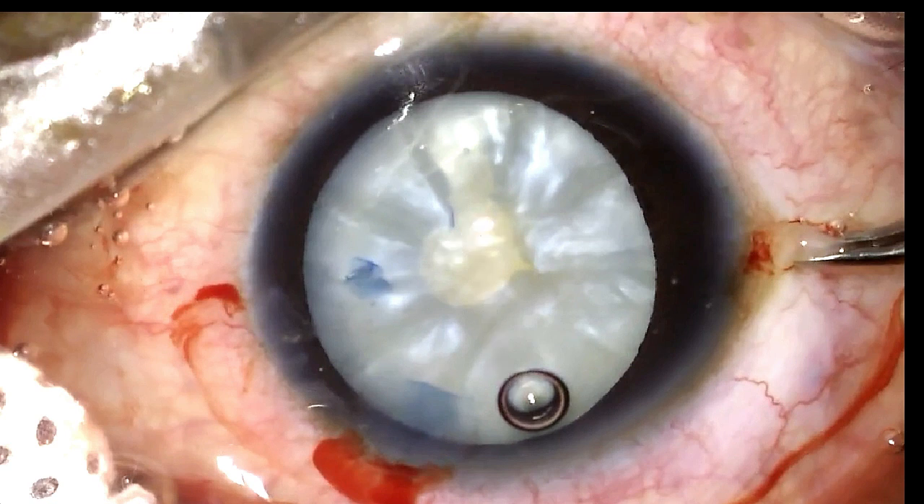So what are my options here? Either I enlarge this capsulotomy by making multiple cuts in the anterior capsule and convert to a manual SICS, but what I decided to do is try to enlarge the rhexis and attempt to perform phacoemulsification. Let's see how we managed this case.